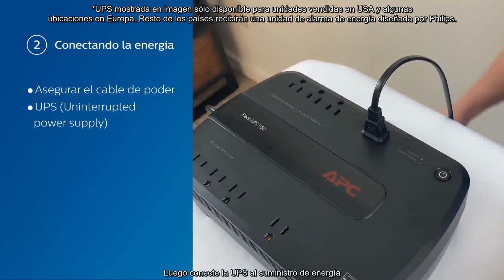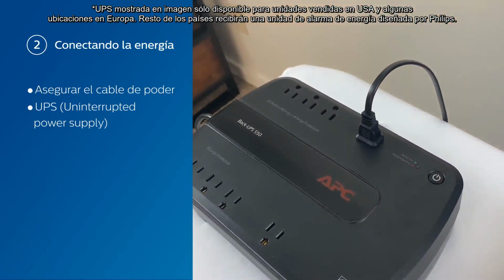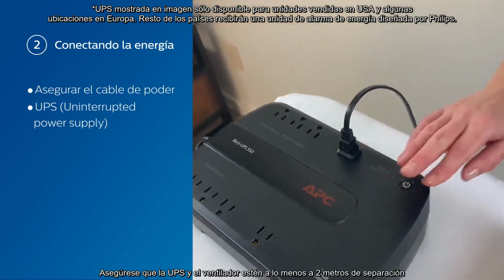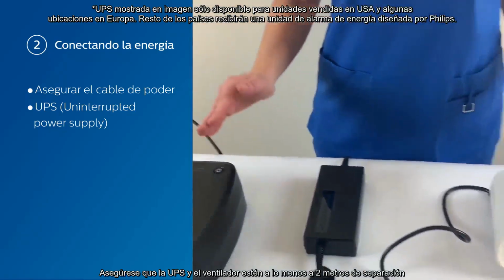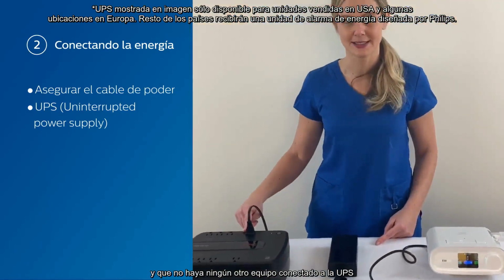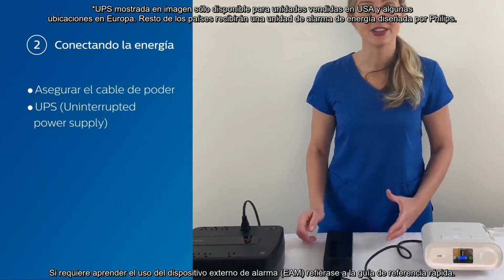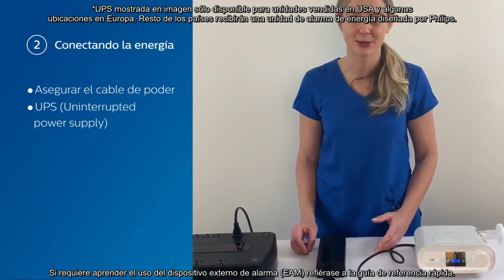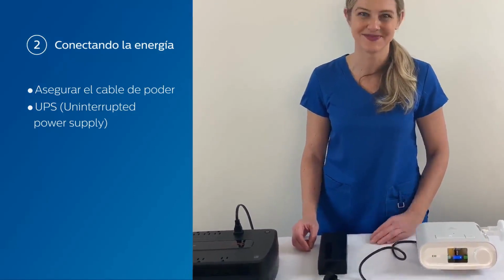Next, plug in the UPS to the wall and ensure that the power is on. You want to ensure that the UPS and the device are at least 2 meters apart and that there's no other equipment connected to the UPS. If you want to learn how to use the EAM, the external alarm module, refer to the OIS or the Quick Start Guide.